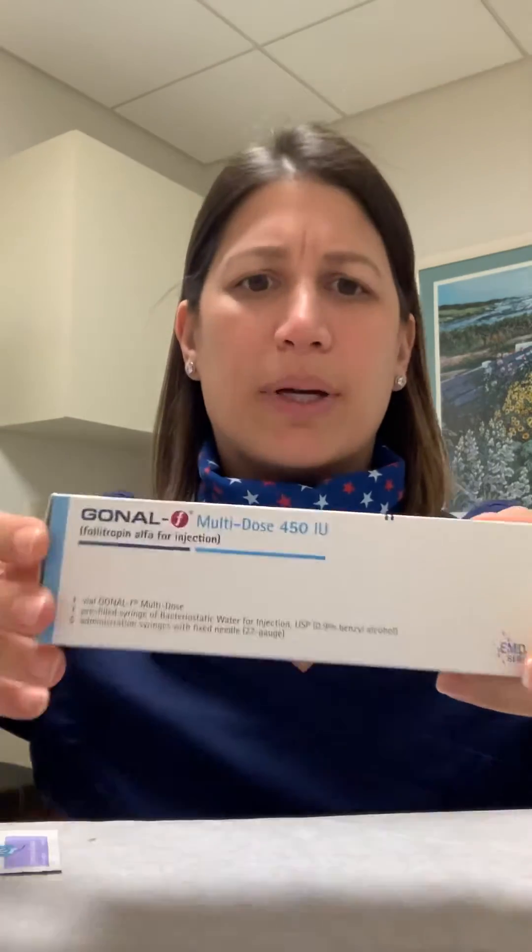If you are using a multi-dose Gonal F, that means it comes as a kit. It will come in a box like this, maybe a little bit larger, but it will say multi-dose 450 on it. With this one, it says 450, but it's overfilled, so you actually get 600 units out of it.